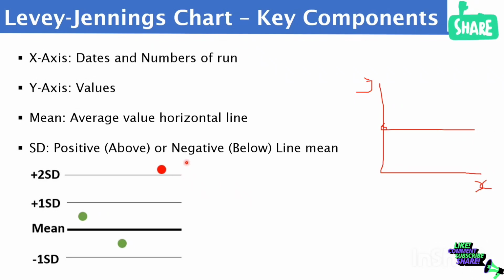What I mean is that the SOP and the analyzer may not be the problem. The step-by-step that you take may not be the problem. Maybe there can be something like human error. For example, imagine not mixing the sample very well can give this point here. So once you get it, it does not necessarily mean that something is wrong.